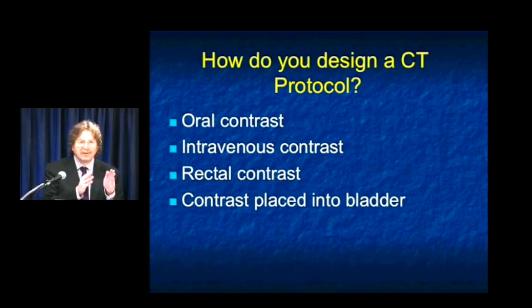All of those things should be designed. So if you have a pancreas protocol, is it water? Is it positive contrast? You use IV, how fast do you inject? How much do you inject? You have pelvic trauma, you're worrying about bladder injury, CT cystogram, how much contrast do you put in? Do you get non-contrast? Do you get delayed? What exactly do you do?